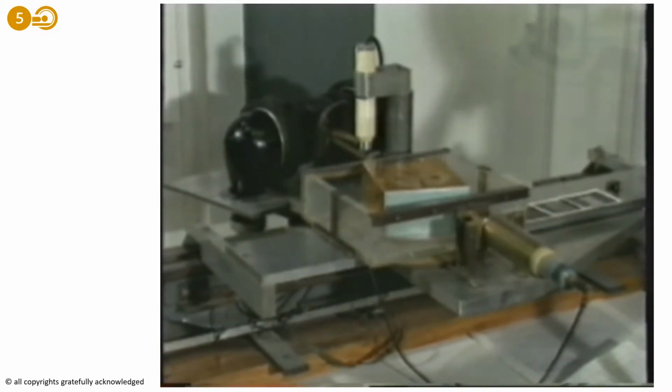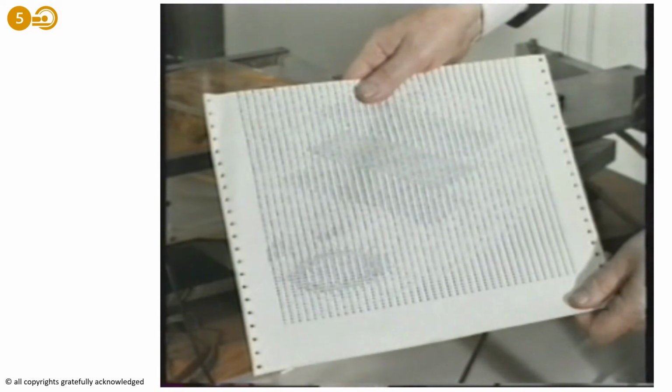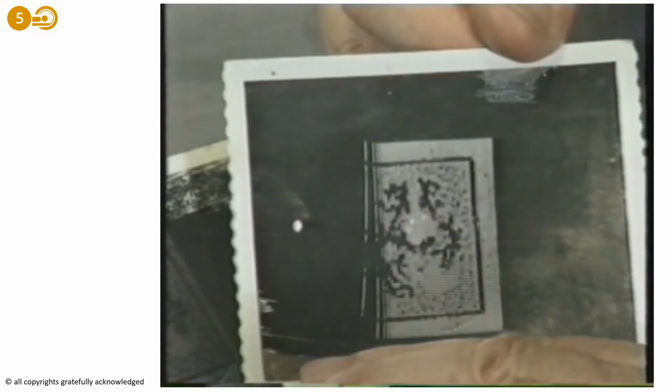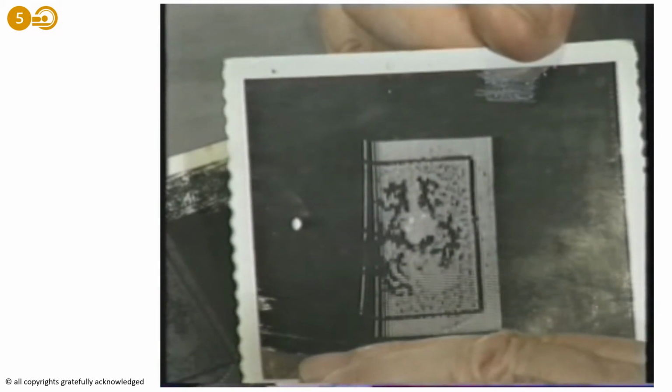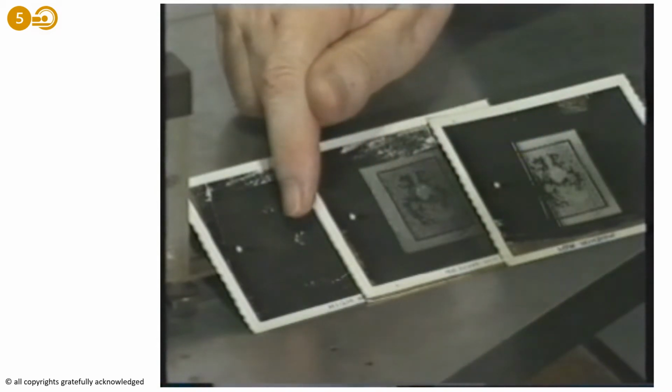The values given by the detector were recorded on paper tape and passed to a computer. This mathematically reconstructed a picture of the density of each pixel of the material within the slice. This is the first rather incomplete picture we took of this pickled brain, showing a tumour at 3 different window heights. Later all manner of things were scanned, including cow's brains, pig's bodies, bones, tumours and many other things, which led us to believe that a clinical machine would be quite worthwhile building.